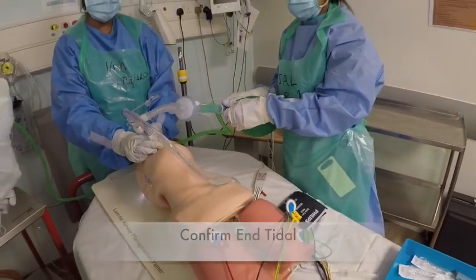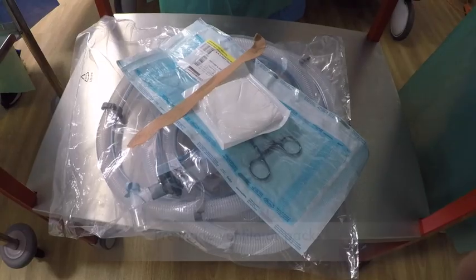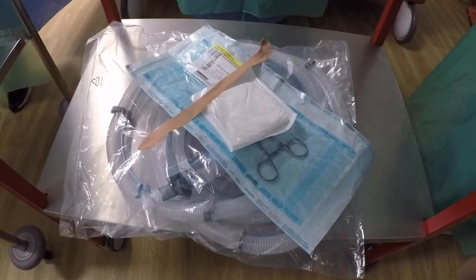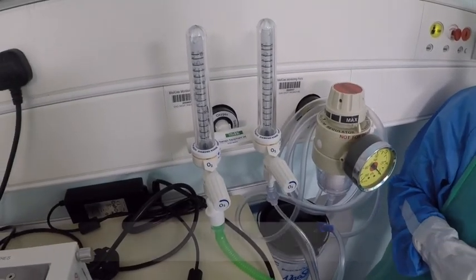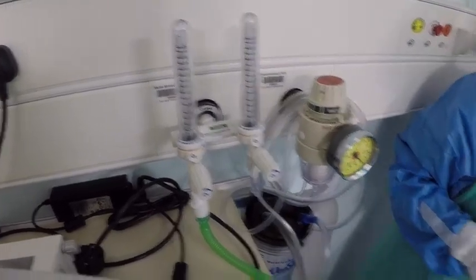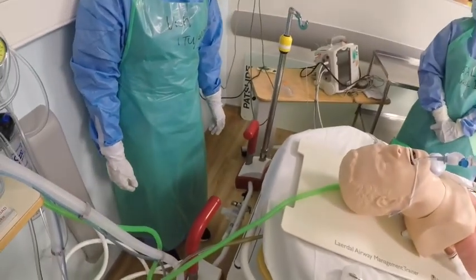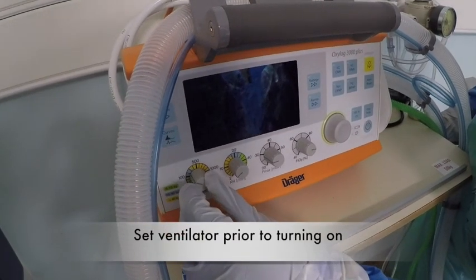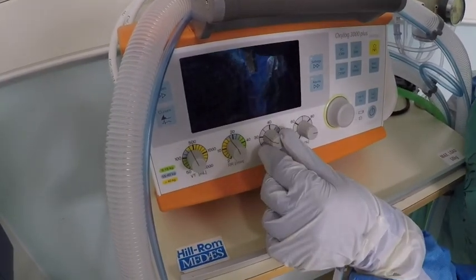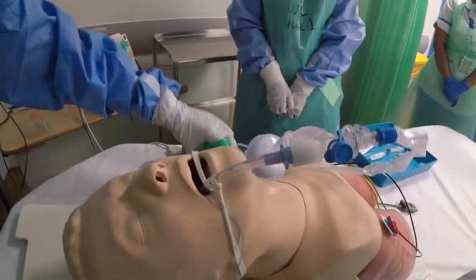When end-tidal is confirmed, the tube can be secured as normal. With regard to ventilation, we have designed a pre-made pack which will be hung on the side of the airway trolley. This pack includes the ventilator circuit, forceps, and gauze. It is important to highlight that there is only one Schrader valve in each of the ED respiratory resus bays currently, and this has the oxygen flow meters attached. Therefore a second oxygen source must be in the room for the ventilator to be attached to — we are trying to get bulk oxygen installed for a second Schrader valve port. The anticipated ventilator settings should be pre-programmed prior to turning it on. The aim is to have the ventilator on in the room but not connected to the patient for the minimum amount of time, to reduce the amount of aerosolised particles moved around the room.